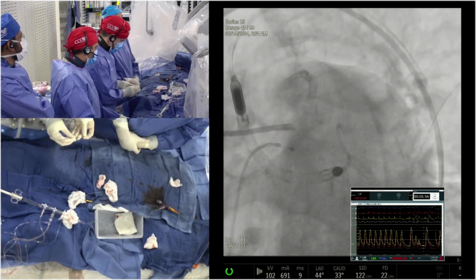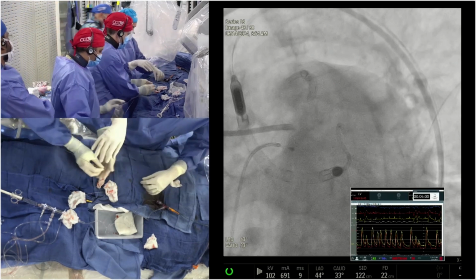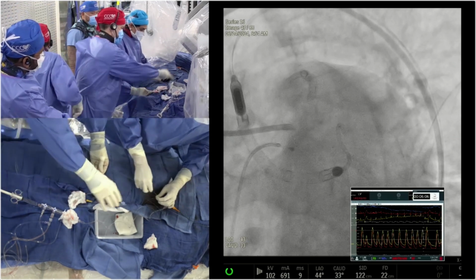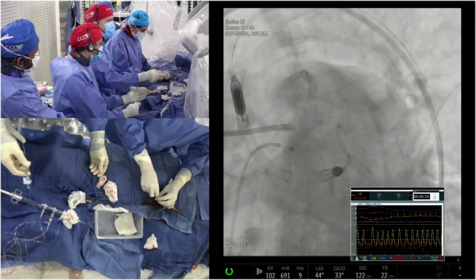I don't know what the rest of the people think. Any addition, Dr. Richaporia? No, I agree. I also think that less is more in this. Yeah. Dr. Kinney, I know you were thinking about 2 stents. Where do you stand now?